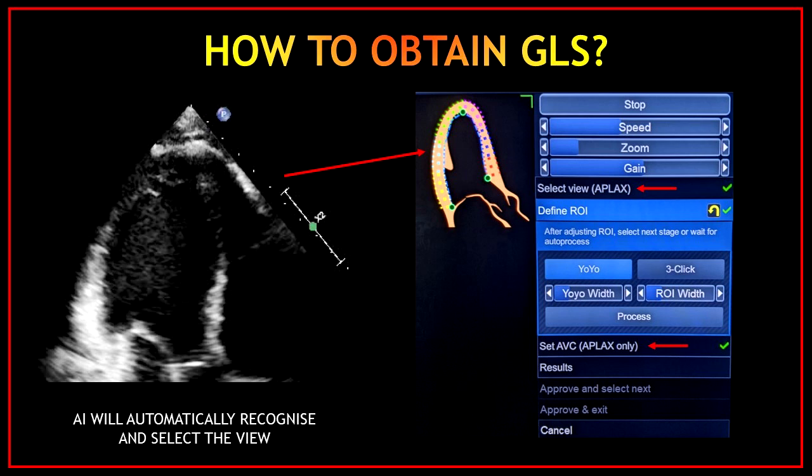Don't worry if you don't have this software, because you can do this manually. On the blue menu on your right-hand side, I'm showing you with red arrows where to click to select the view. In this case, just click apical three-chamber view. You have to do this with all the views. The idea is to select and recognize the views before you can process any information.